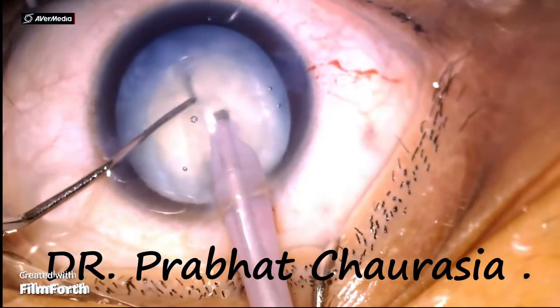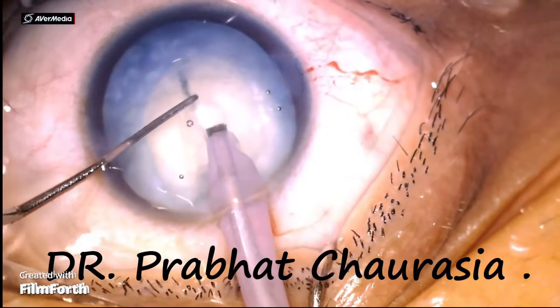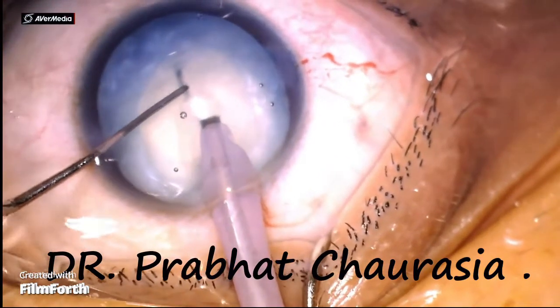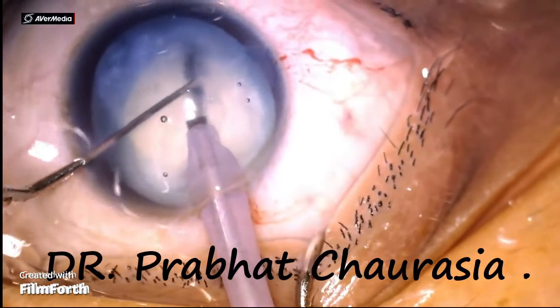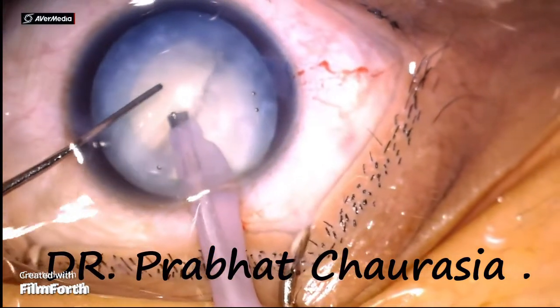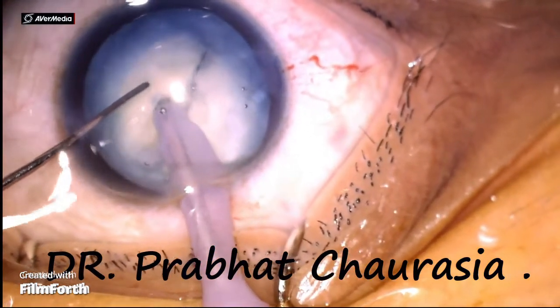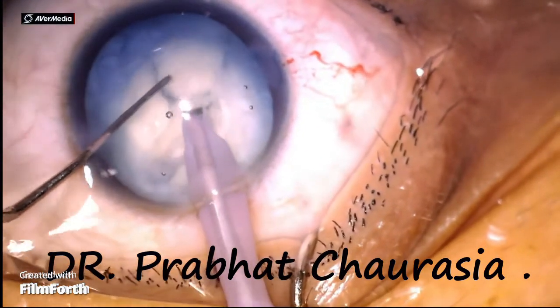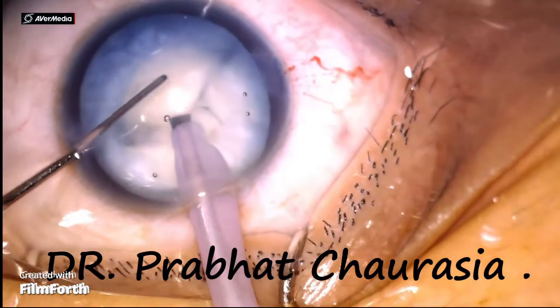Now rotate the two hemi-nuclei about 45 degrees and again do the chop — this is a horizontal chop. Make 2 to 3 pieces of each hemi-nuclei, and this will help you while emulsifying the nuclear pieces.